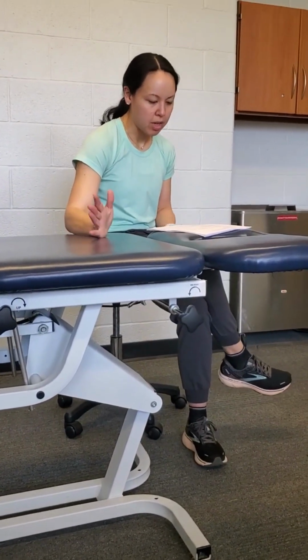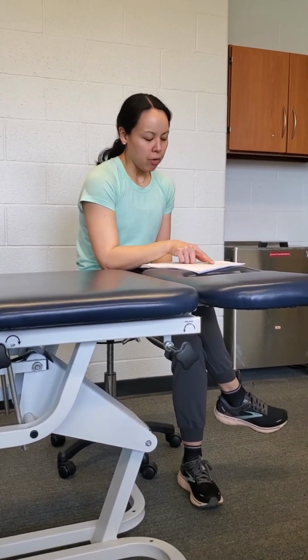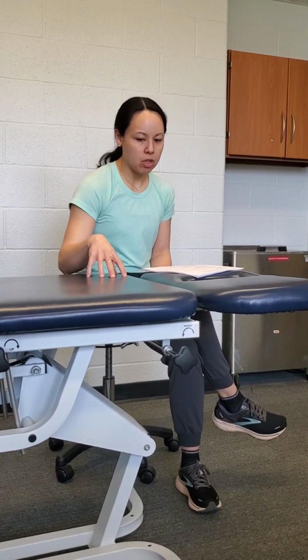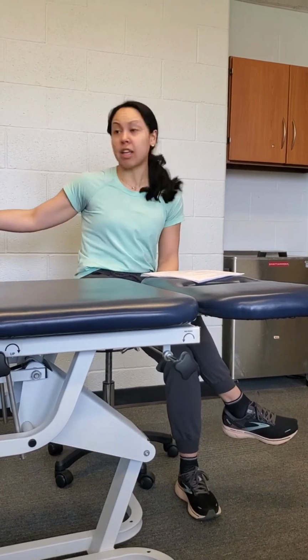Okay, so I'll just talk briefly. I think you guys have an idea of what BFR is, but for documentation purposes, this is the first thing he talked about: you certainly want to document in your note the patient's personalized pressure, which is calculated by the machine, and then the total tourniquet time.